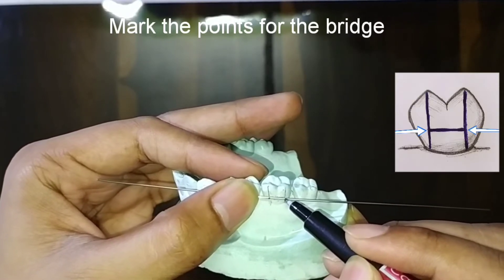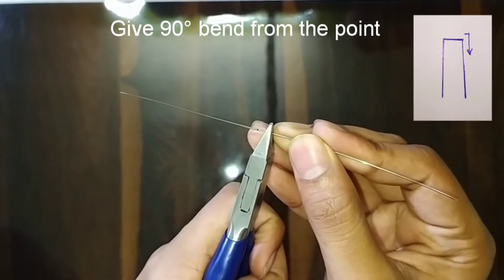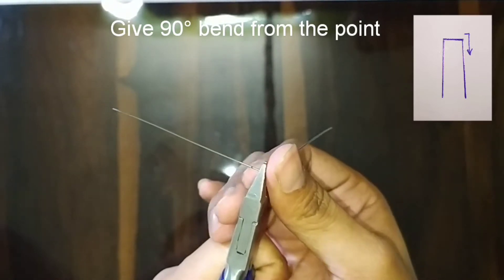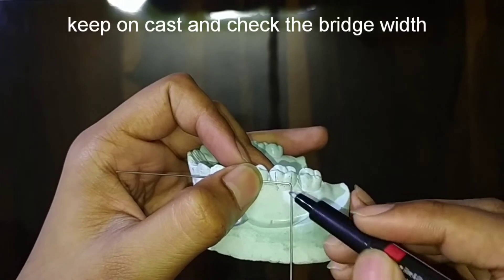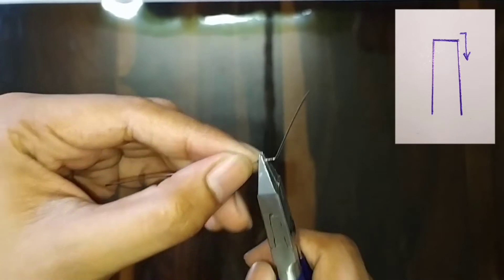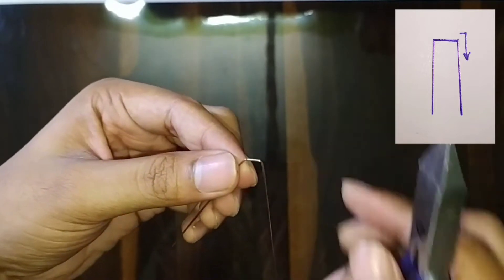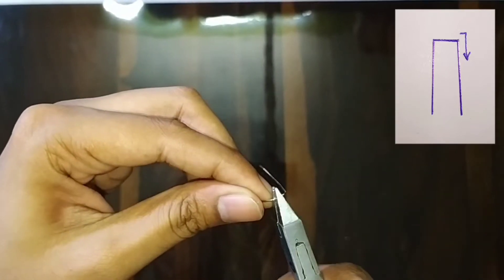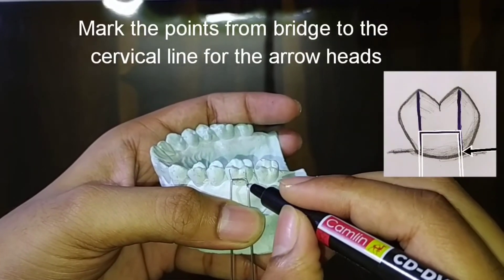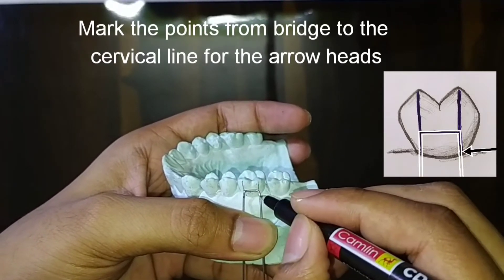Do the marking as shown in the figure. After this, with the help of the Adams plier, give a 90-degree bend to the wire as shown in the figure. Check on the cast, do the marking, and give another such bend. Then hold the wire from the bridge and mark the points on the wire at the cervical line for the arrowheads.